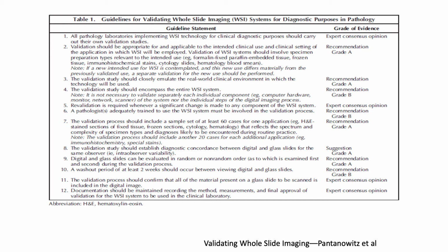All pathology laboratories implementing WSI technology for clinical diagnostic purposes should carry out their own validation studies. The validation study should closely emulate the real-world clinical environment in which the technology will be used. A pathologist adequately trained to use the WSI system must be involved in the validation process.